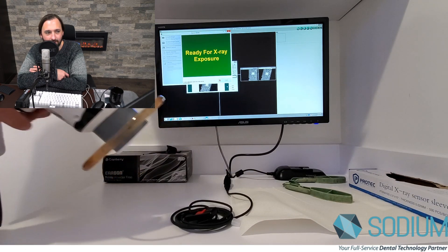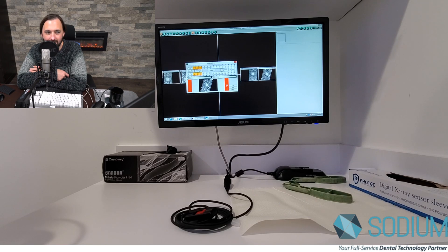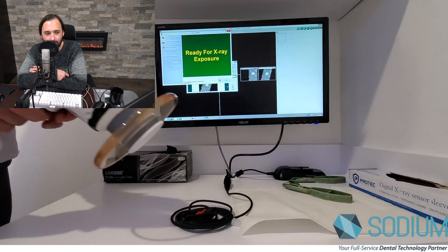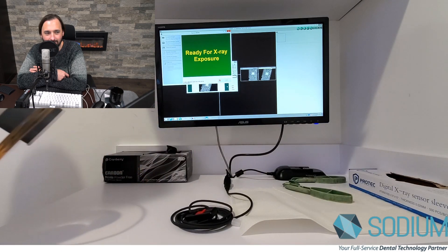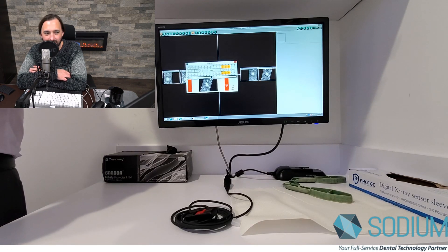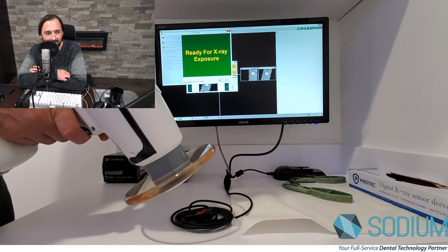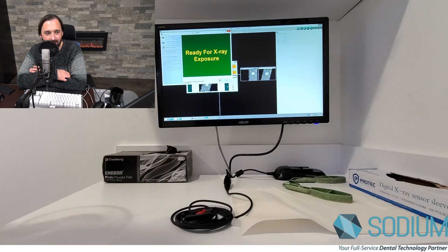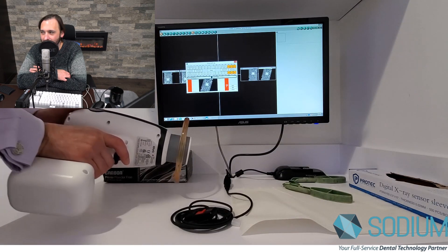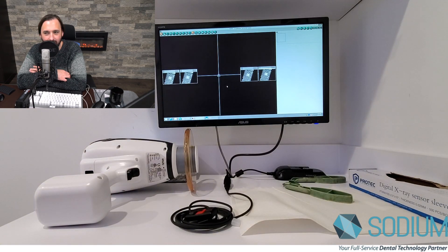Now, depending on the speed of your computer, this can happen faster on a faster machine, or a little slower on a slower machine. The added couple of seconds is because of the TWAIN interaction, but it could be a small price to pay compared to literally paying a gigantic price for Dexus Platinums that fail or sensors that aren't covered under warranty. You're back up and recapturing about every five or six seconds if you have a quick computer.